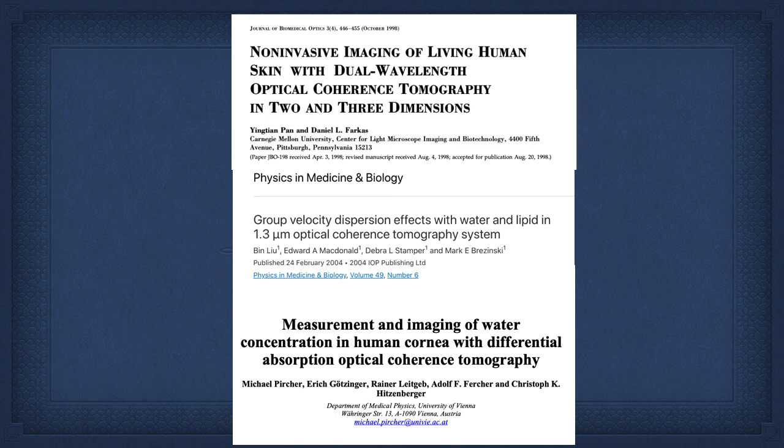So we looked at group velocity dispersion. That's our paper in the next line. Well, if you go to the third paper, these dual wavelength techniques, or these absorption techniques, are useful in the eye, but as I point out many, many times, the eye is transparent tissue. It minimally scatters. It's not the same world as the coronary artery.